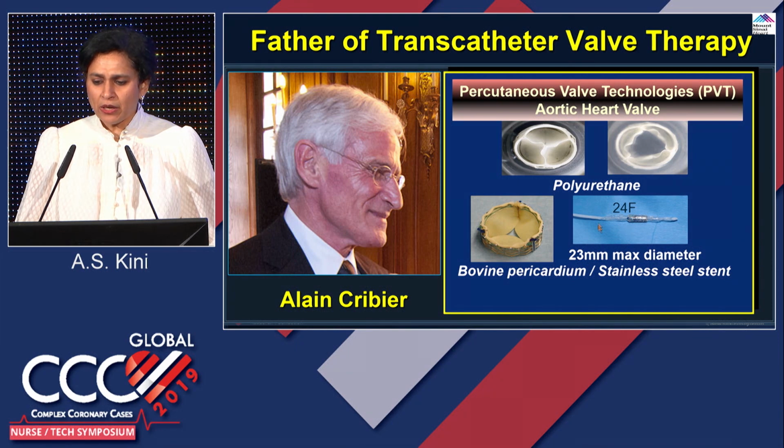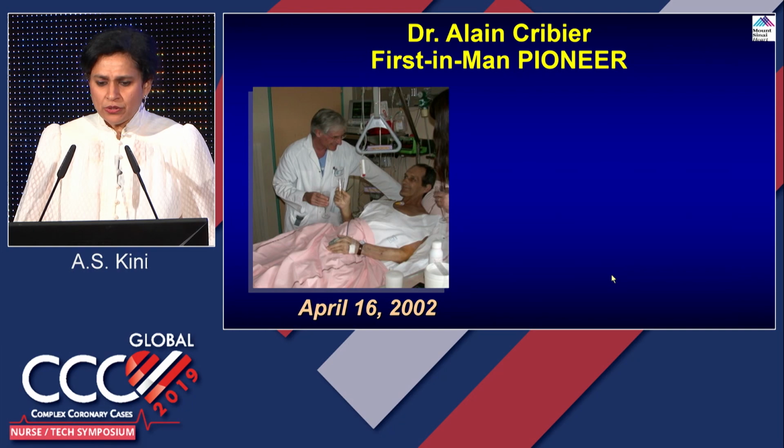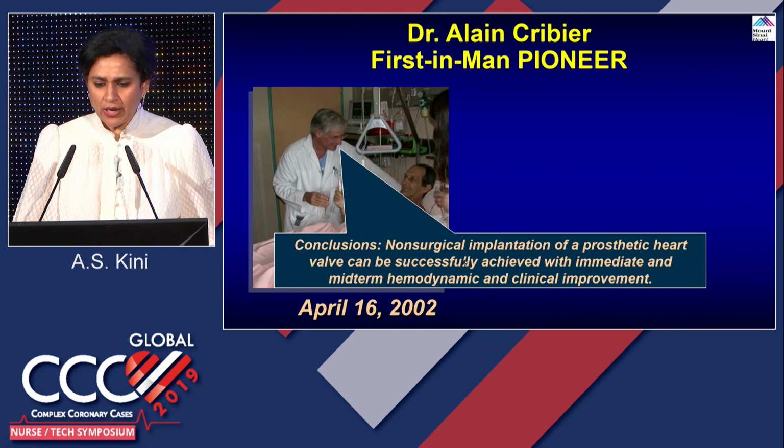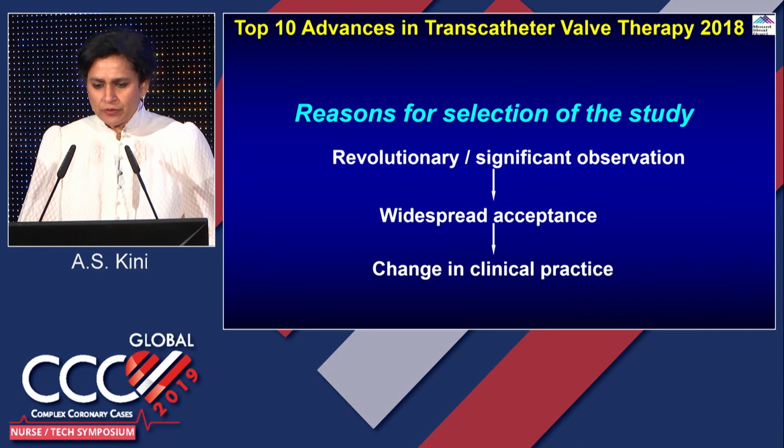But in the early part, if you see how it happened, it was 24 French. So the first person that he replaced, you see that? His conclusion: non-surgical implantation of the prosthetic heart valve can be successfully achieved with immediate and midterm hemodynamic and clinical improvement. 2002, and it came out in Circulation as a publication.